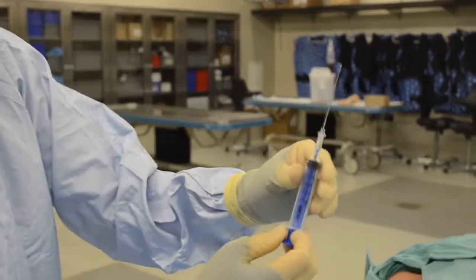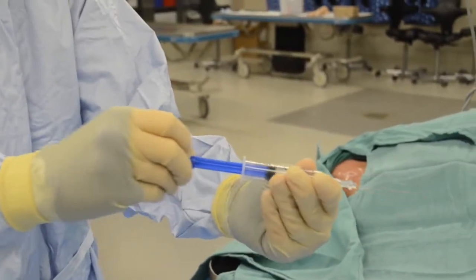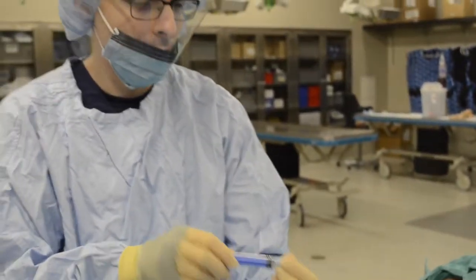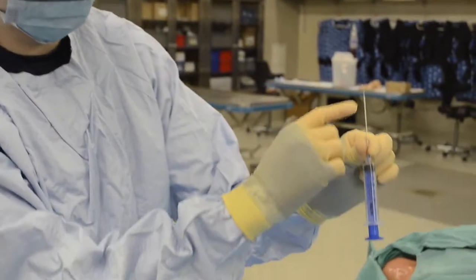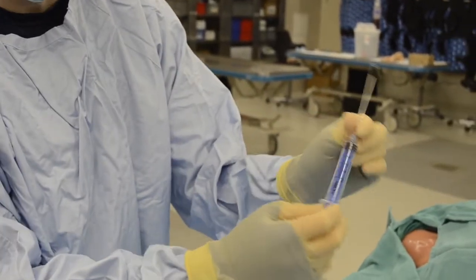To get this ready for use, there's a couple things you need to do. One, you need to go up and down in the plunger. The first time you do it, it's a little tight, so you need to make sure it moves easily. Next, I loosen this just a little bit to make sure that this slides off very easily, and that my bevel is on the same side as the numbers. That way I always know where my bevel is facing up.